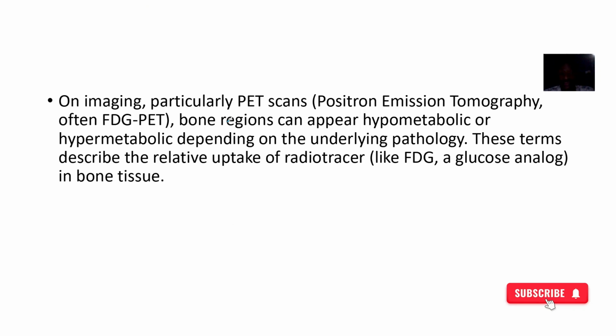So for these ones, what we got is this. On imaging, particularly when you're talking about PET scans, bone regions can appear what? Hypometabolic or hypermetabolic, and this depends on the issue. Okay, so of course those terms depend on the underlying pathology, right?